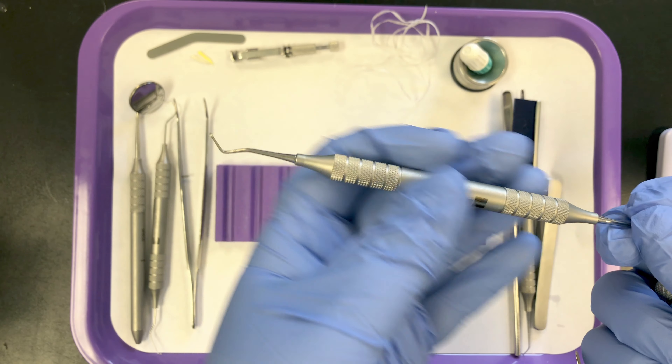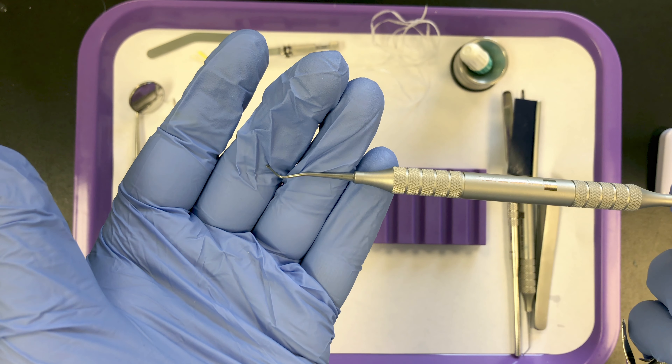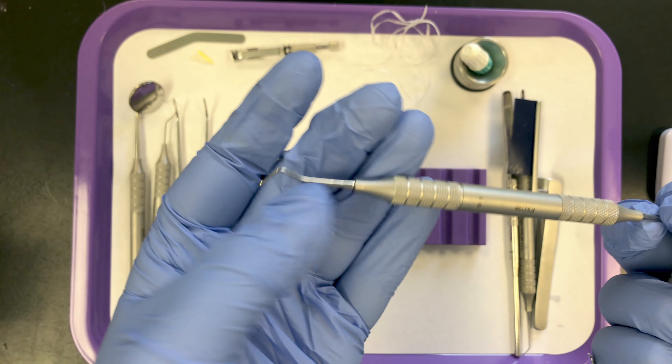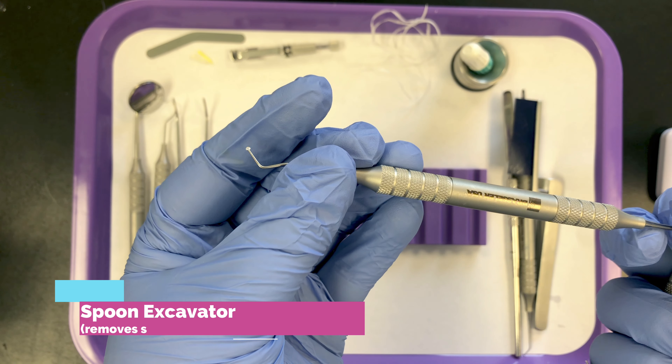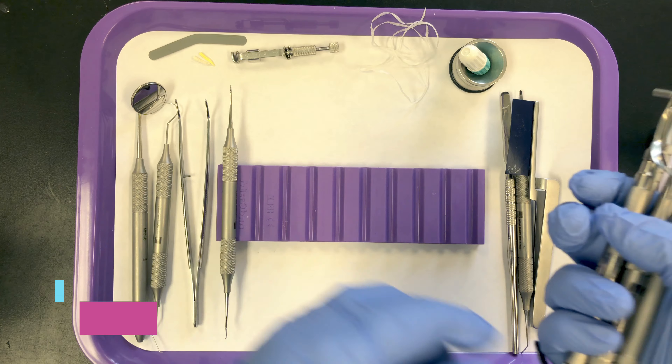Then we place our hand cutting instruments. Most doctors today use handpieces and burrs, but they'll always have a spoon excavator. So the spoon excavator goes next on the tray.